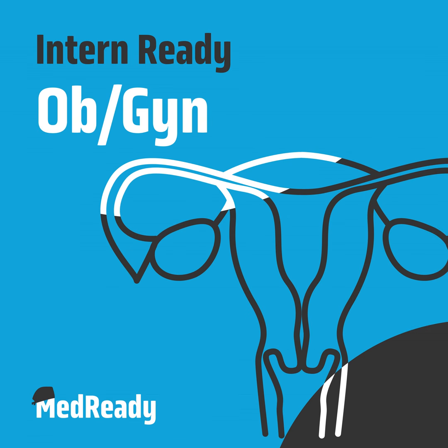The other things I'm looking up are any medical comorbidities. So do they have any cardiac, renal, pulmonary disease? This is really important in a hysteroscopy because for folks that are more sensitive to fluid shifts in the body, it helps you determine whether or not you have a lower fluid management threshold for them. And then if they've had prior cervical procedures or risk factors for stenosis, especially being postmenopausal, I think about that as well in terms of knowing that it might be a little bit more difficult to dilate them.